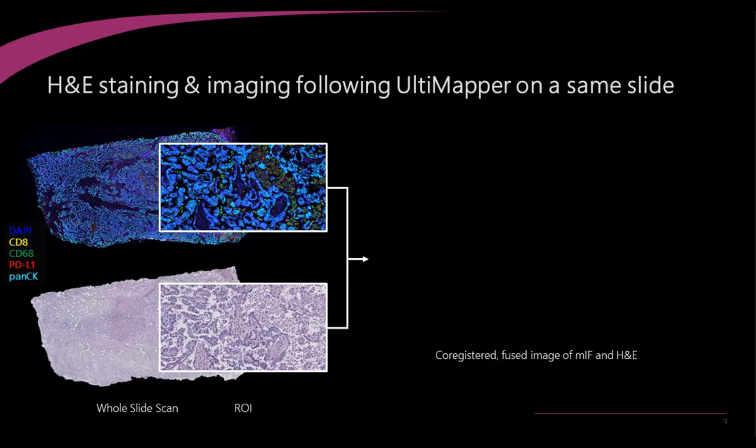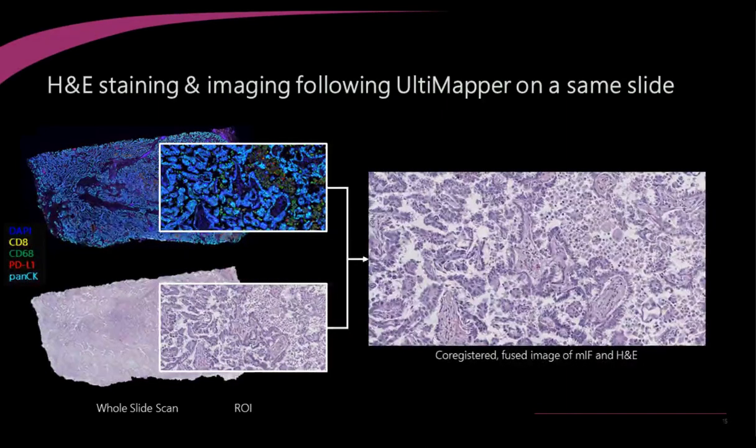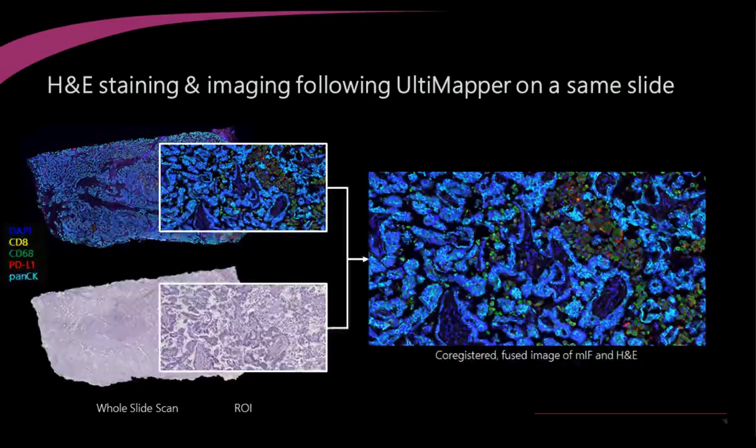Pathologists are trained in bright field. They're trained in pattern recognition, and sometimes fluorescence can be a quite different platform to interpret and read. So being able to get an H&E of the exact same slide you're doing your fluorescence assay on has been a tremendous asset to our pathologist friends out there that are adopting or working with fluorescent-based assays. To highlight that, I want to show a very nice registration of the fluorescence overlaid on an H&E.